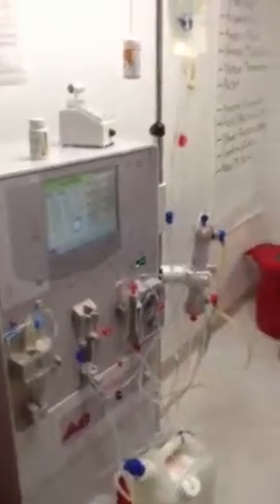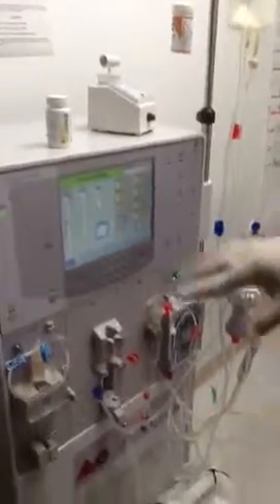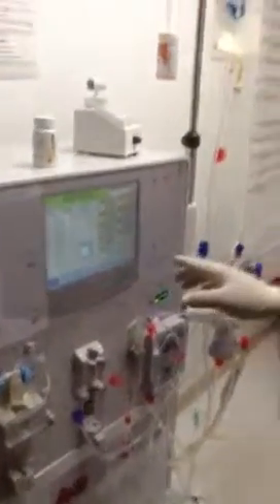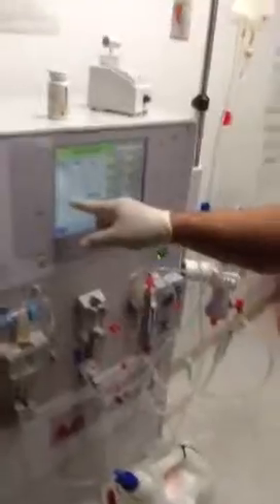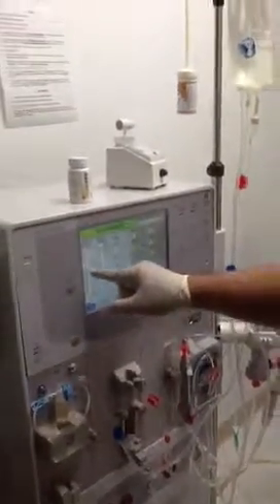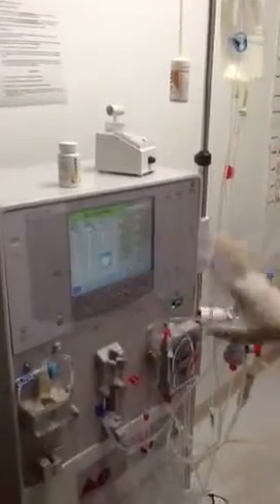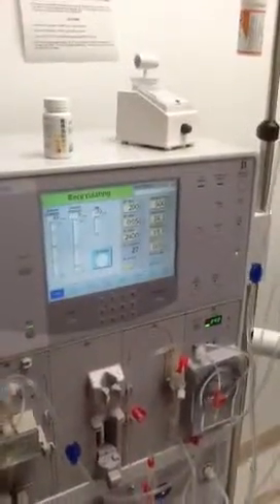To reset the values or limits — if someone was previously using it — hold the reset button for a few seconds. You can push override and hold it, and it'll reset the limits so you won't have any problems. Just push reset before you walk away.